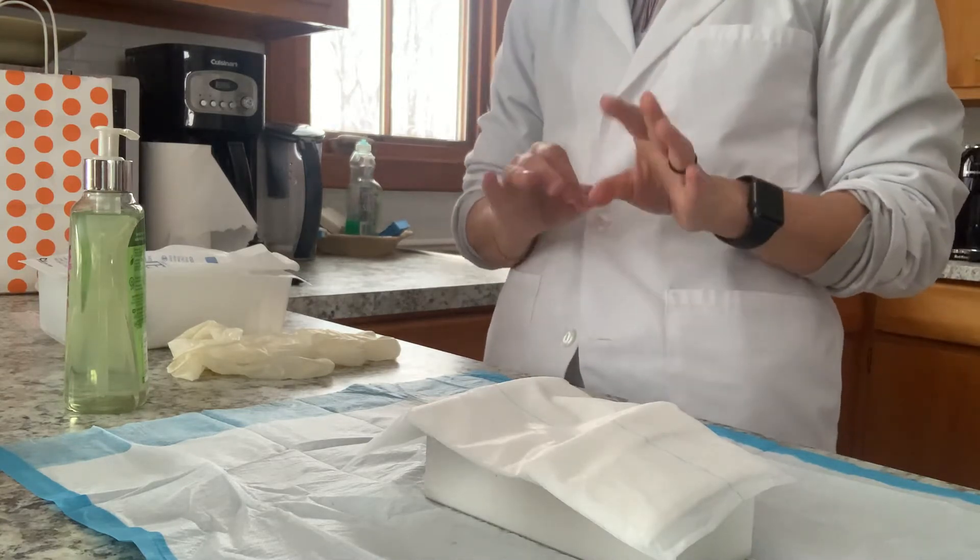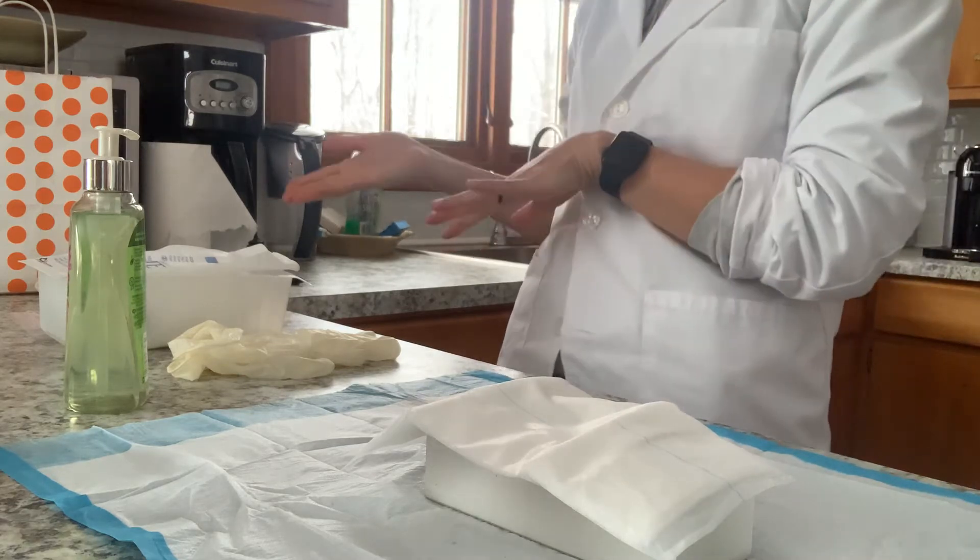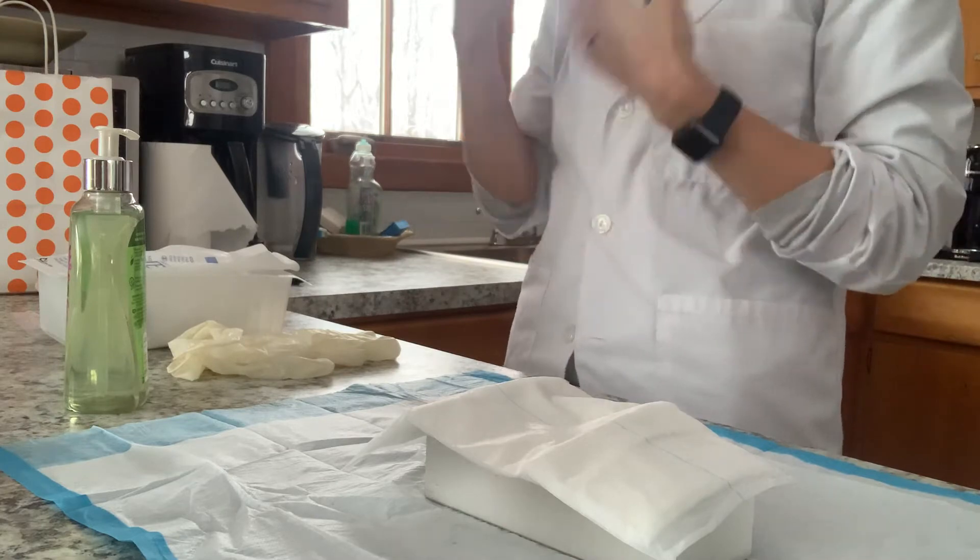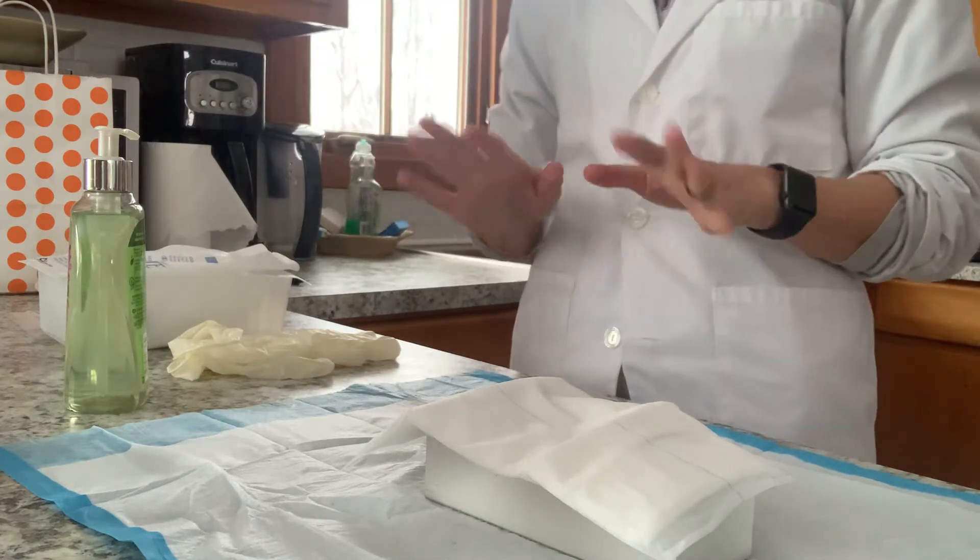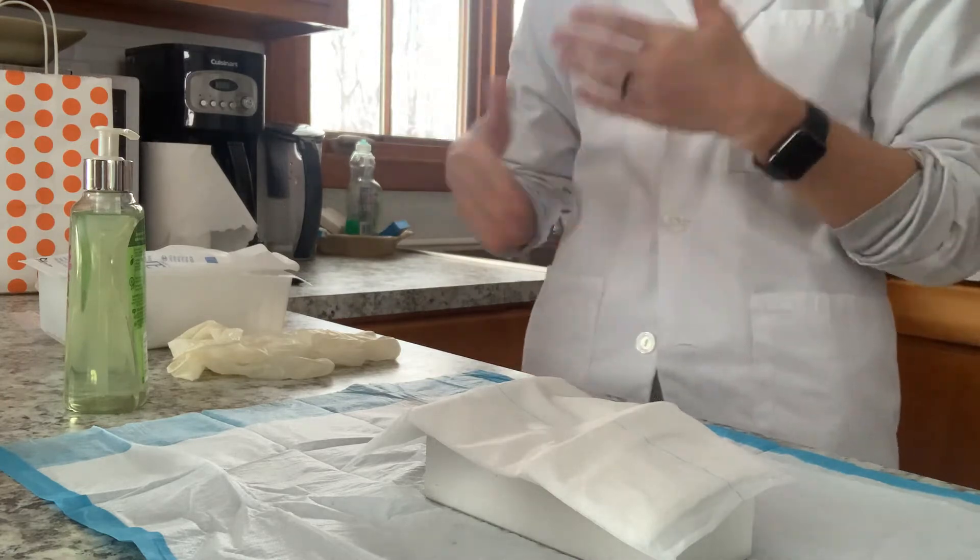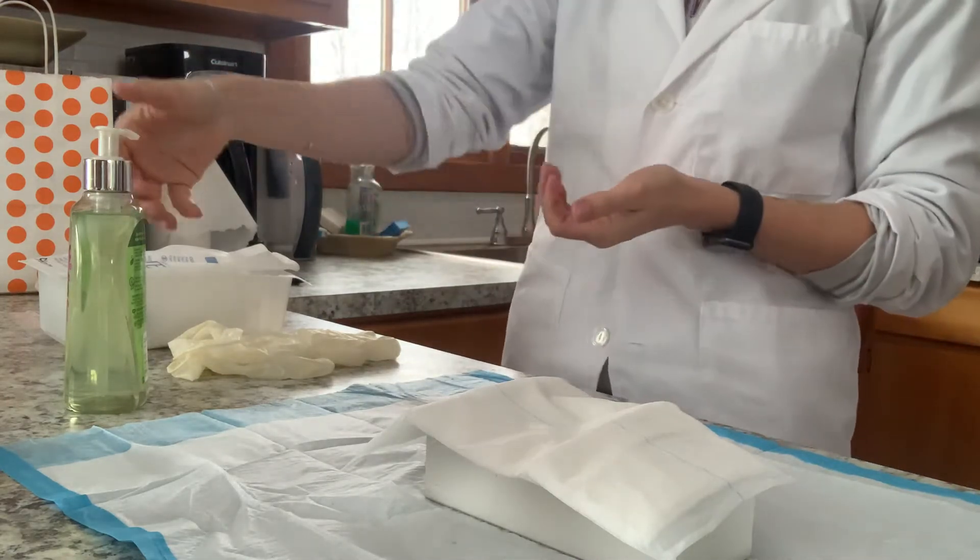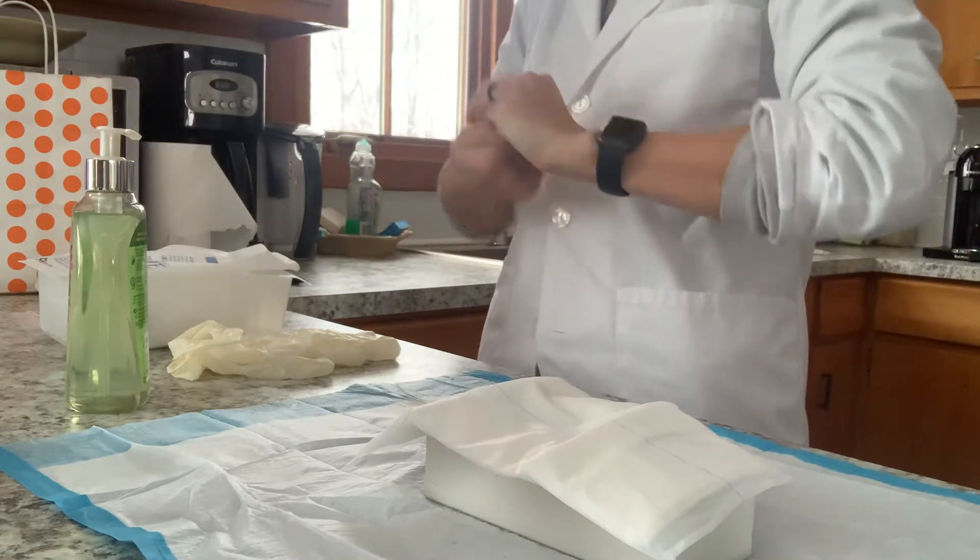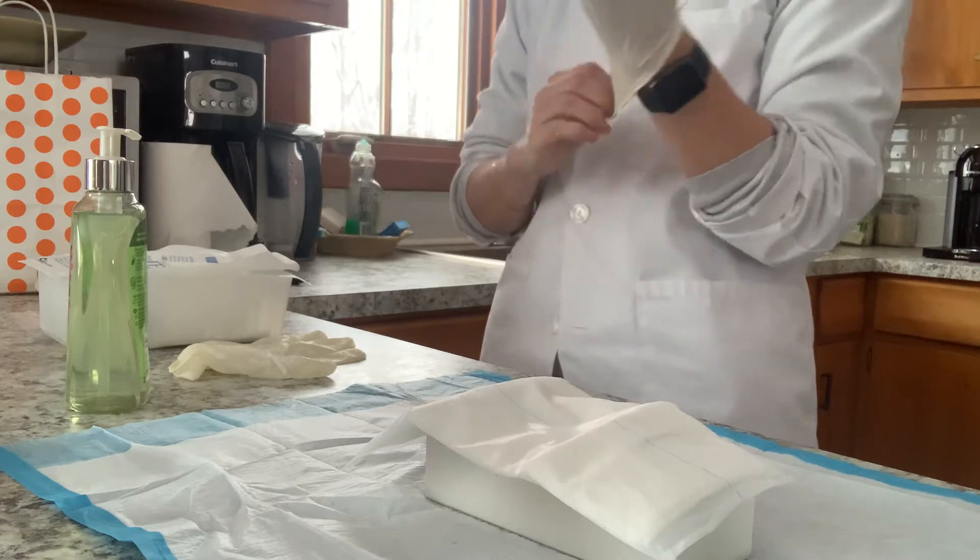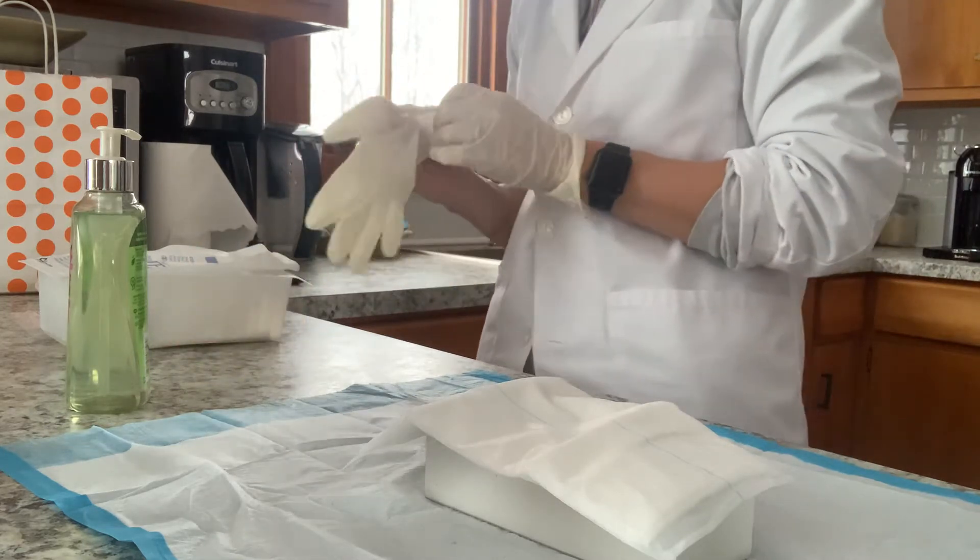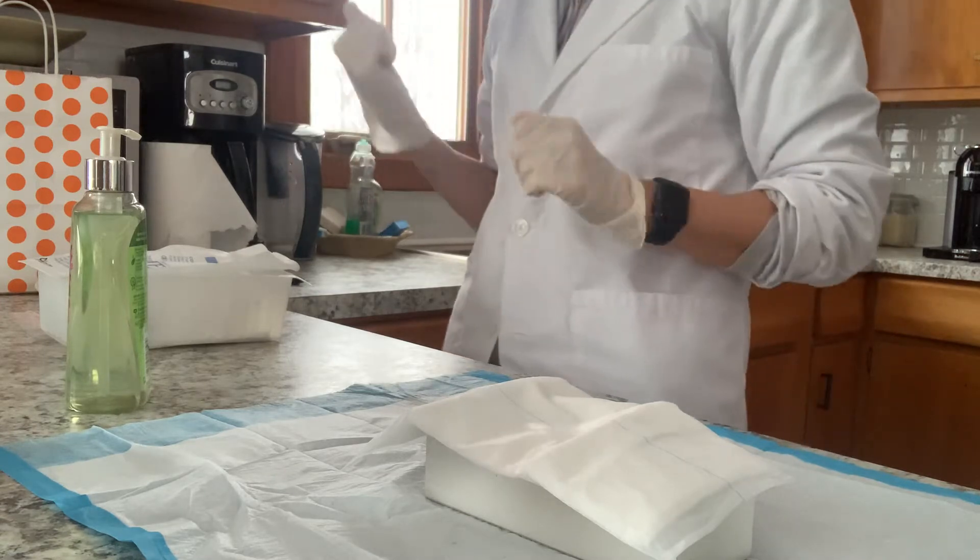So, because he said that he is feeling zero pain, we're going to go ahead and change the bandage. In this part, we're going to be changing the bandage and doing his culture. And then we will move on to the sterile dressing. We're a little awkward, so I apologize if anything is out of place. So anyway, I would perform hand hygiene, I would put on some clean gloves that would be coming out of a box.